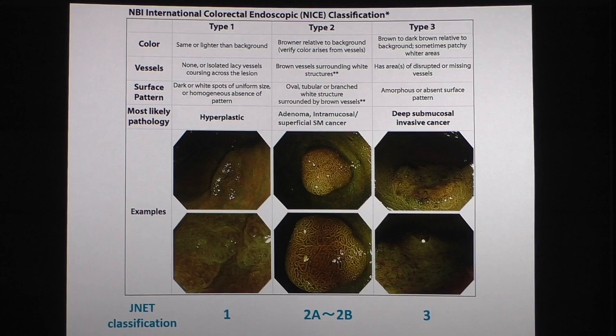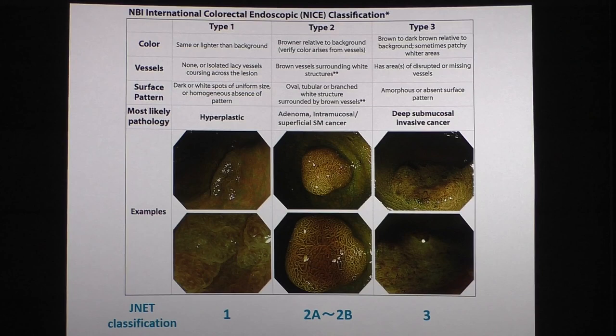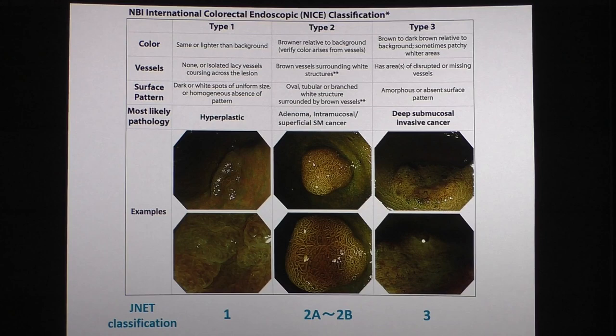However, the inconvenient aspect of NICE classification is that NICE type 2 includes many things — from adenoma, intramucosal cancer, superficial submucosal cancer, and also possibility of deep submucosal invasive cancer. Based on my experience in Japan, if you can get a scope with magnification, that will be very helpful, because we can perform more detailed histological diagnosis and depth diagnosis.